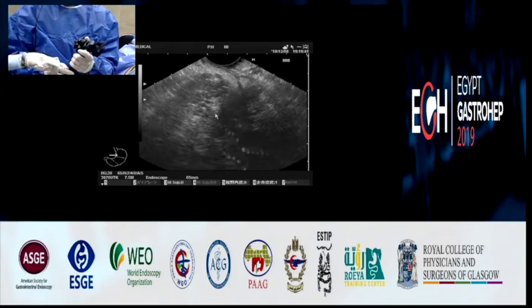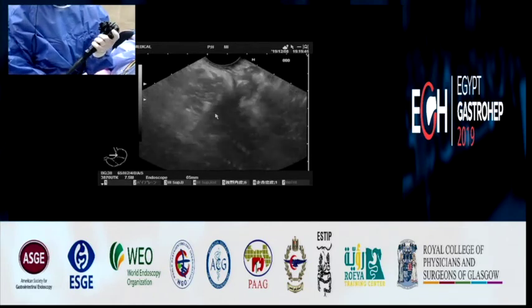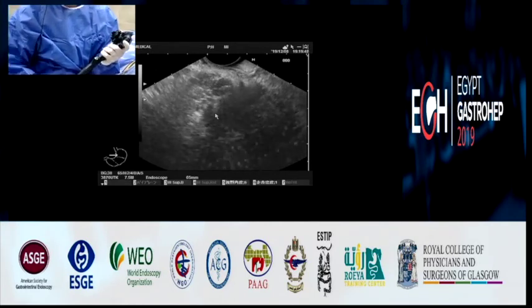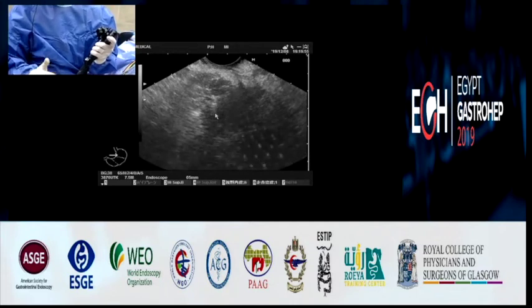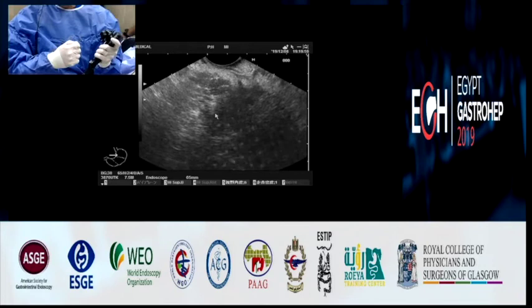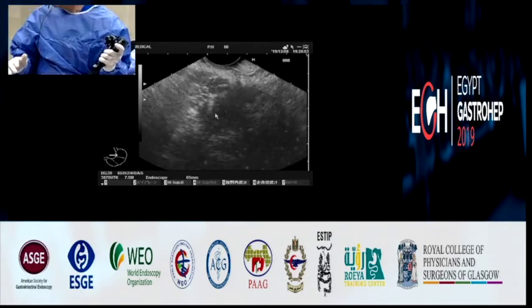There is now a second study, also with very few patients. They show that it's better than performing the back and forth movement always in the same area. Oh, interesting. So we did like 15 to 16 oscillations with the needle under suction, and 10 cc of suction. And now let's see what we've got.